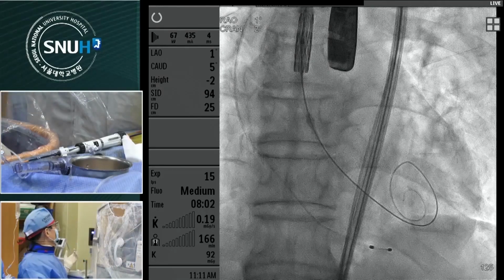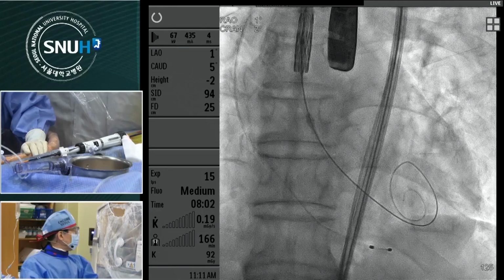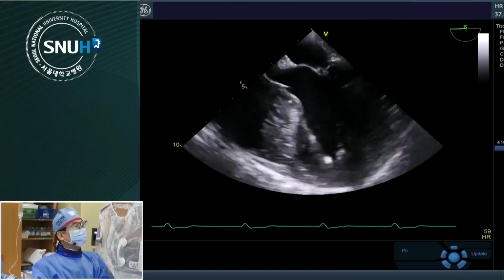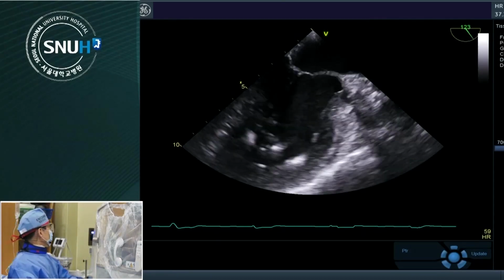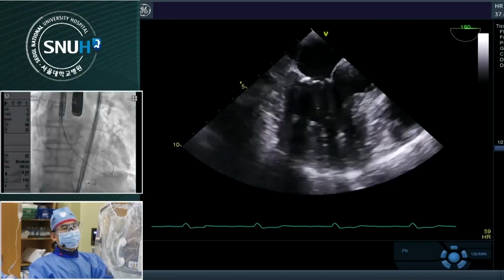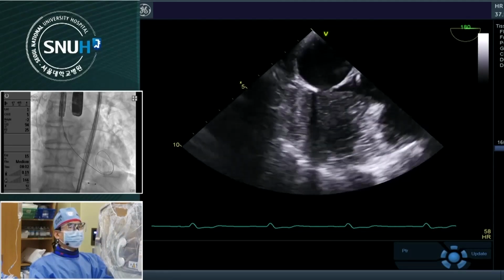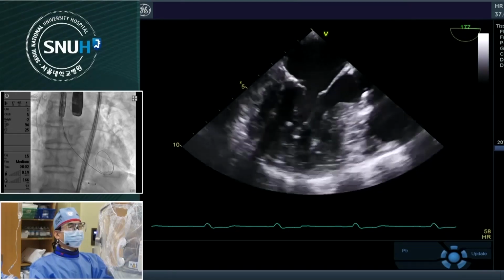Can you see the CT to show that most panels are concerned about the LVOT bulging septum. Is the bulging septum severe? There is a little bit of basal septal hypertrophy, but LVOT, I think it can be acceptable. Aortic valve, show it. Yes. I think this one is very good for us.